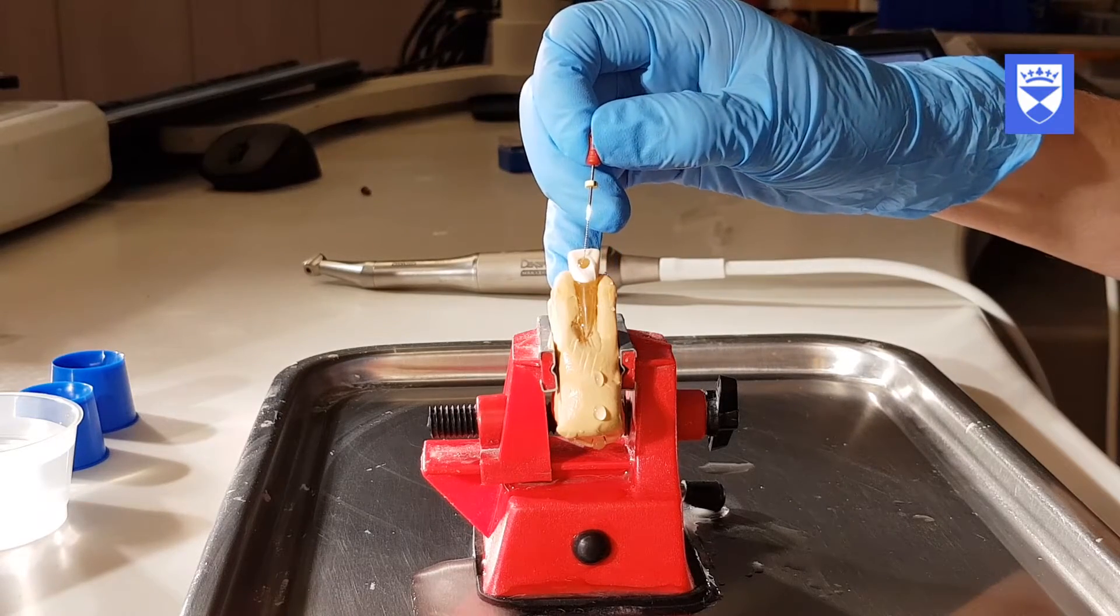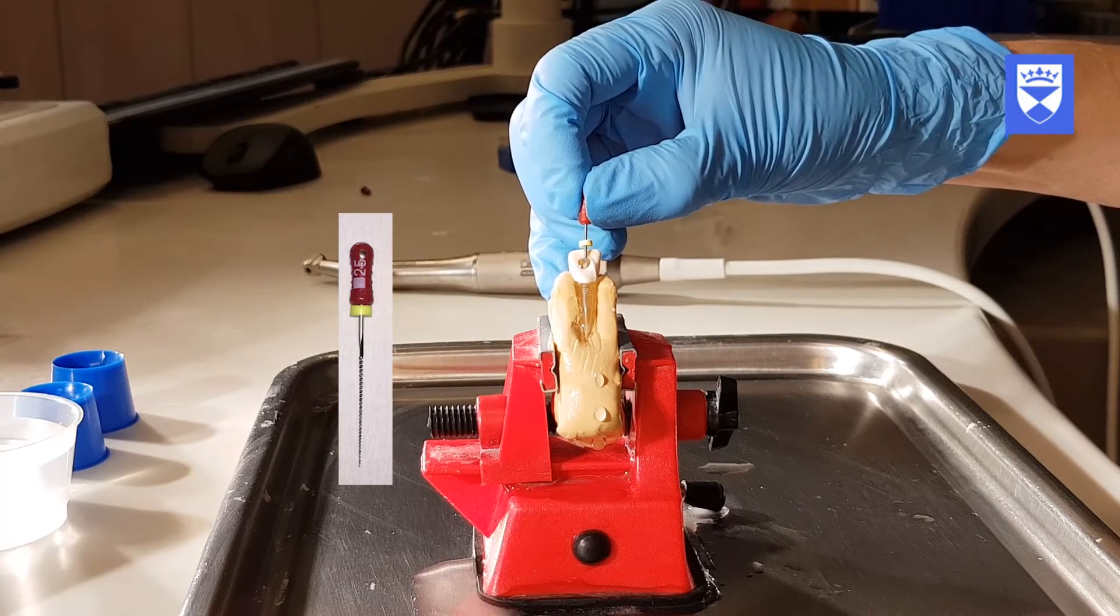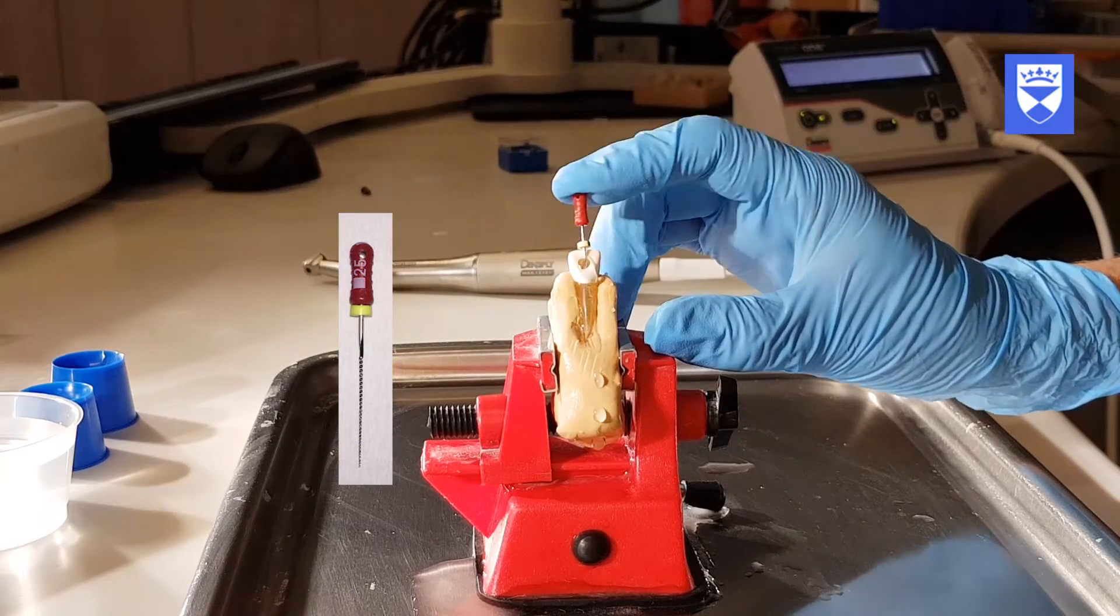When apically gauging with the size 25 flexofile, it is still passing the apical constriction, indicating that the F3 file should be used.